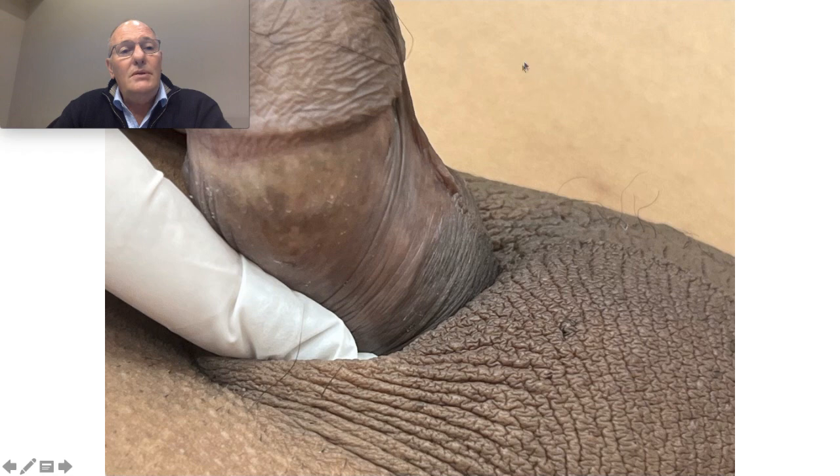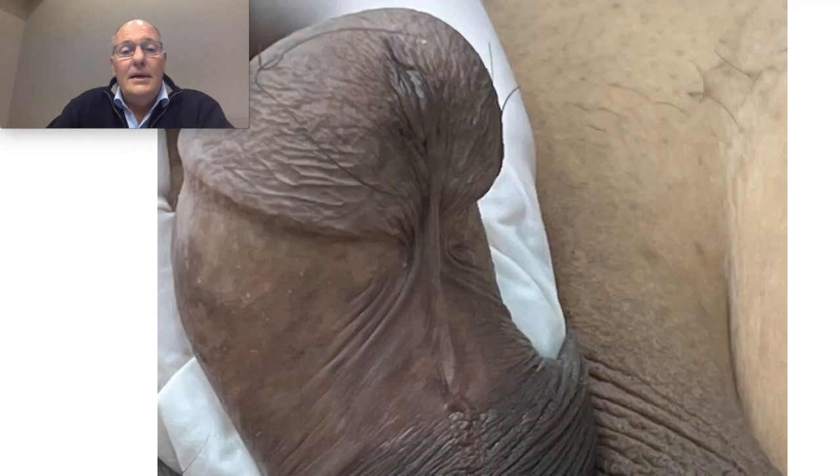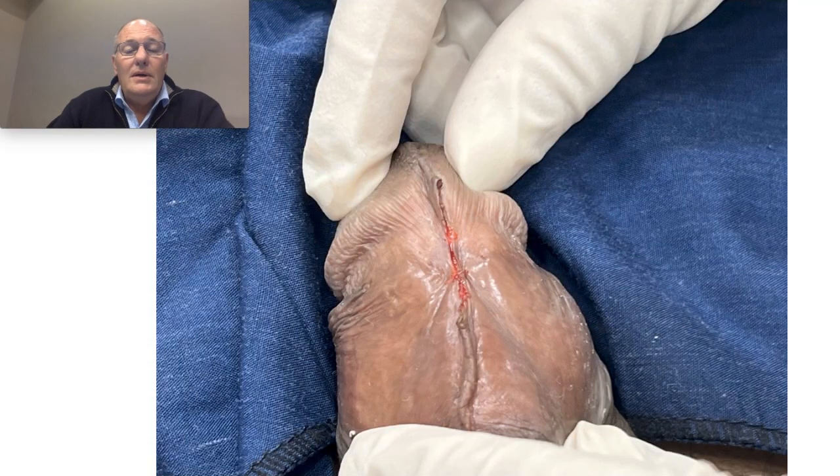I propose a new treatment — a cutting with the laser. Just a little anesthesia here, I cut with the laser, I straighten the head. This is the frenulum — it's a very big frenulum that pulls down the head, as you can see here. This is a procedure of three minutes.